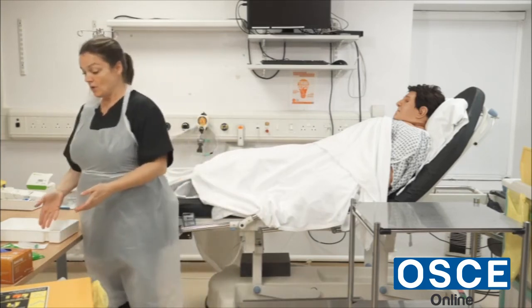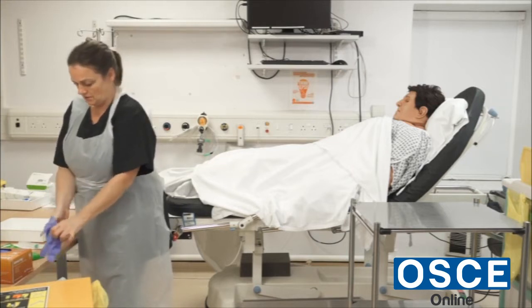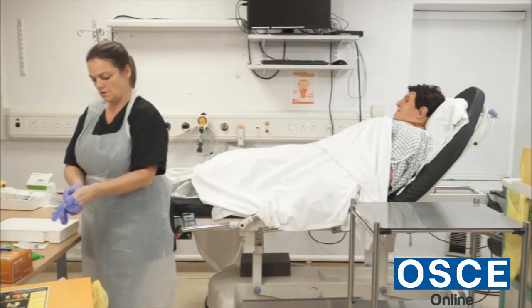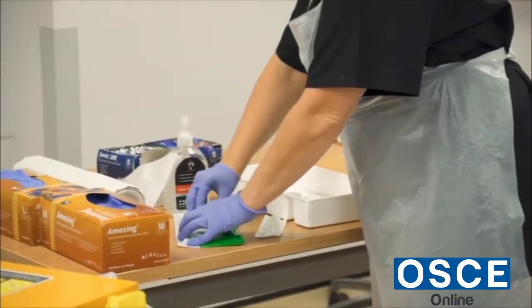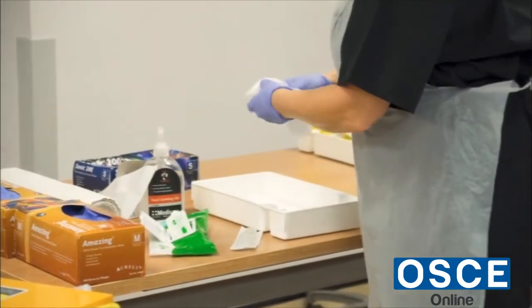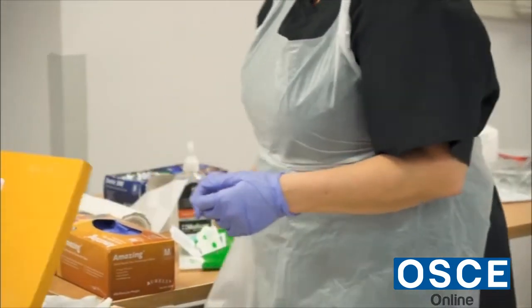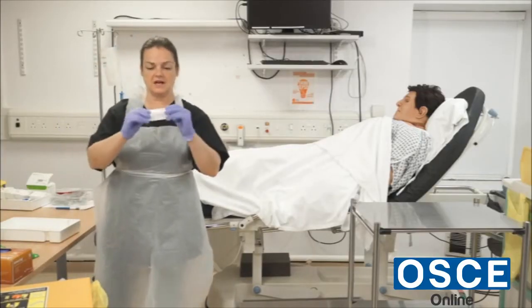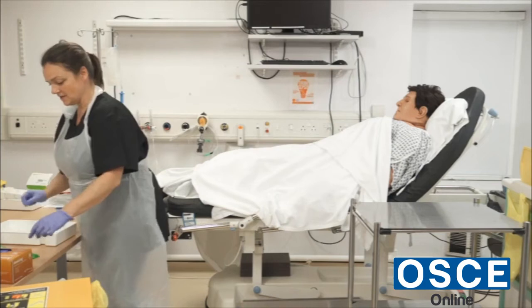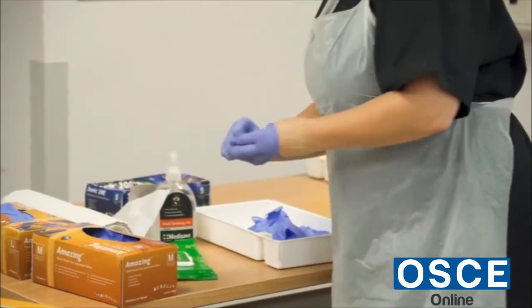I would assume this tray has been washed with soap and water in the past 24 hours. I'm just going to put some gloves on and clean it. I would get a 10 ml syringe — this one is intact and in date until September 2024. I would also take two pairs of gloves with me.